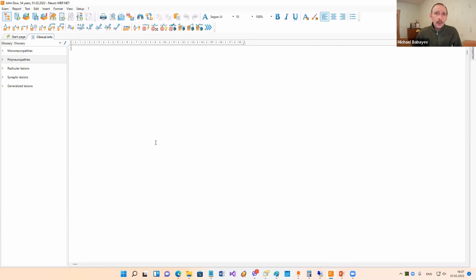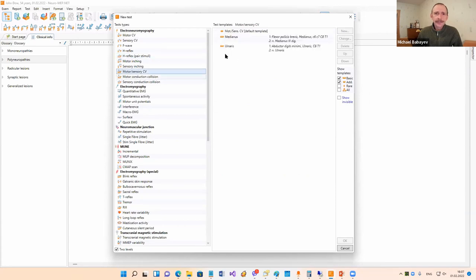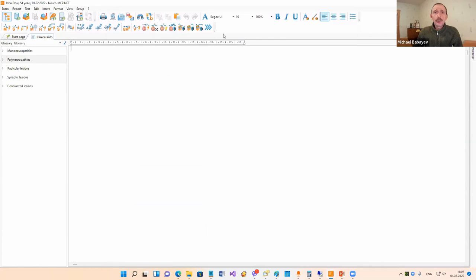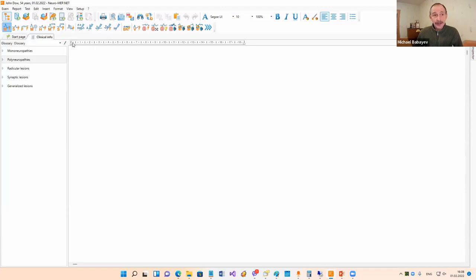Then our task is to select a technique, recording site, stimulation site, and so on. In our program we have more than 60 different techniques. The full list of techniques you can see in Test > New. In this window you can select any technique and any testing template. We have a special toolbar with the most common techniques. We have to make three choices: technique, muscle/nerve, and patient side. These three choices can be done with only two mouse clicks. For example, I would like to select motor conduction velocity, then I select recording site - medianus - and patient side: right. Two mouse clicks.